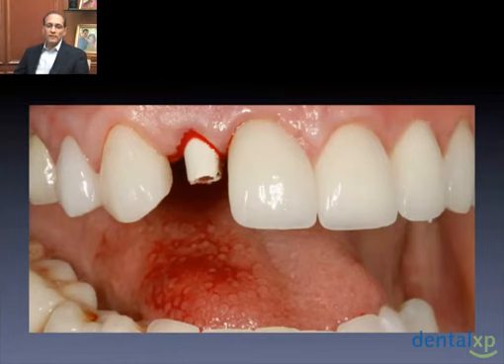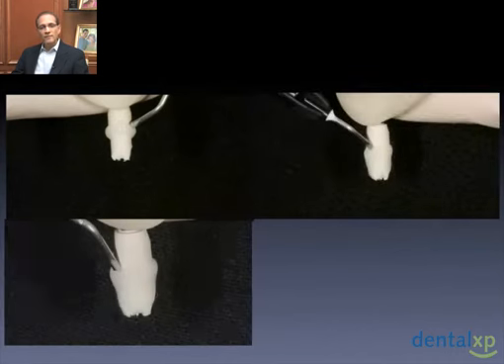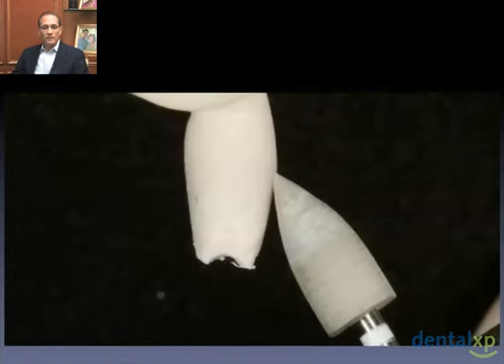Now, in my opinion, as I look at this, I realize there's not enough support in soft tissue at this stage. But initially, I want to try the abutment in and see what it gives me and where I need to modify it and what direction I may take. So we'll go ahead and take it out, and as before, we're going to start to add to the subgingival contour and create some of that emergence, again, of what we'd expect for a lateral incisor, and get a shape and contour that we want.